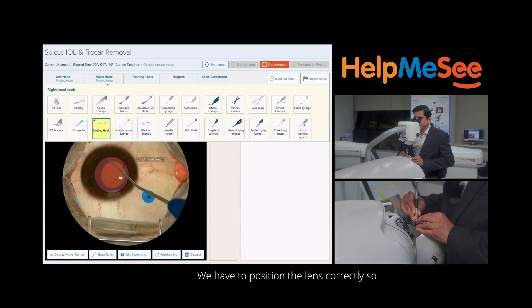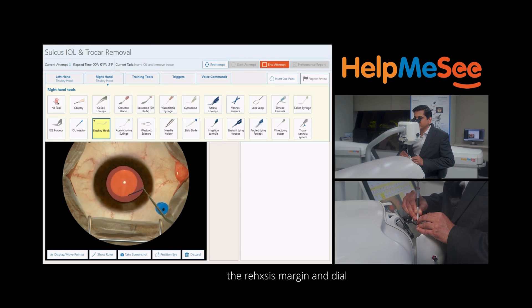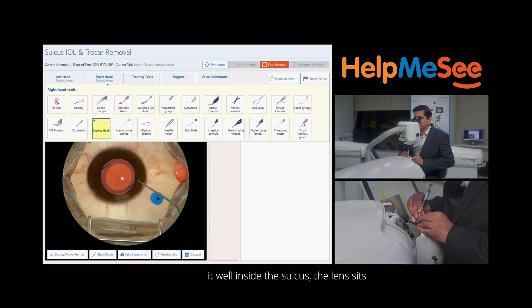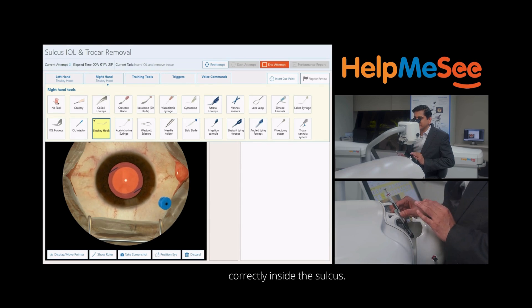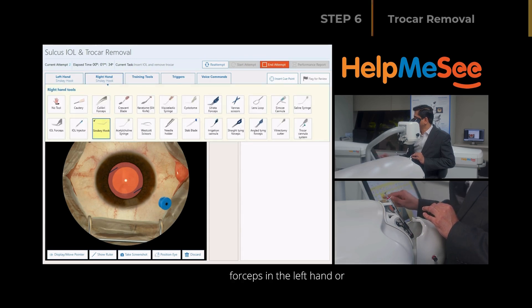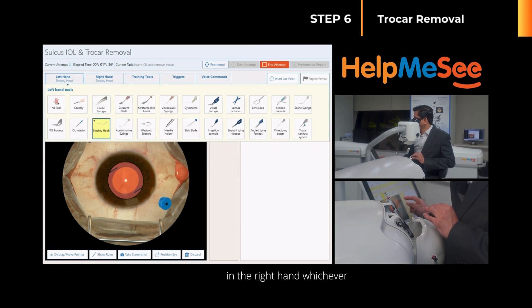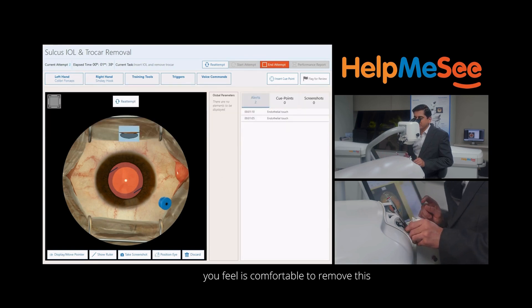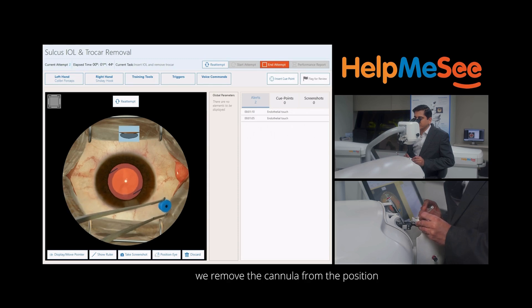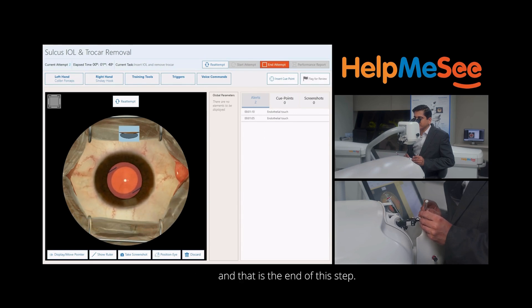We have to position the lens correctly so that it stays over the iris margin and dial it well inside the sulcus. The lens sits correctly inside the sulcus. After this is done we take a colibri forceps in the left hand or in the right hand to remove this cannula and that's the end of the surgical step where we remove the cannula from the position.